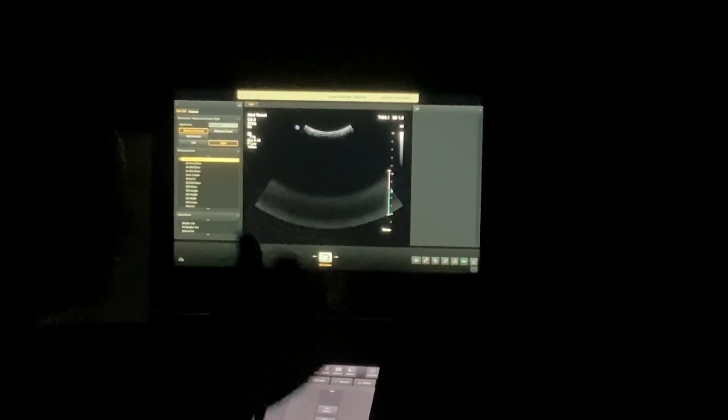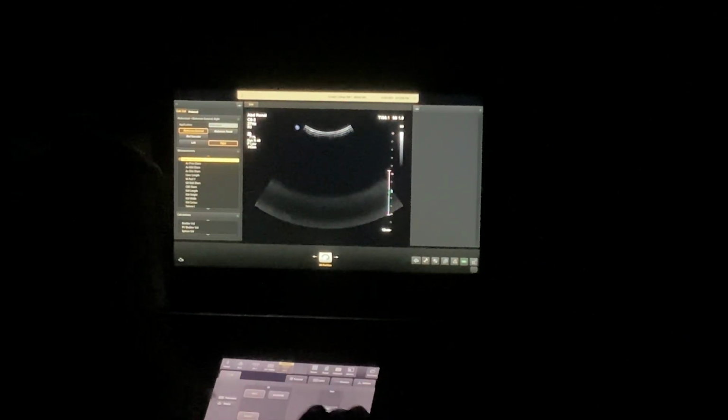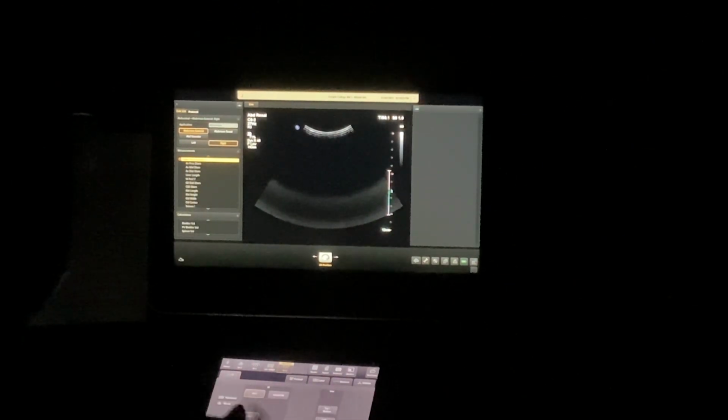You guys haven't done extra credit, right? No, bladder is required in your imaging. Your extra credit is bladder volume. Oh, and getting your kidneys perpendicular is extra credit. That should be easy.